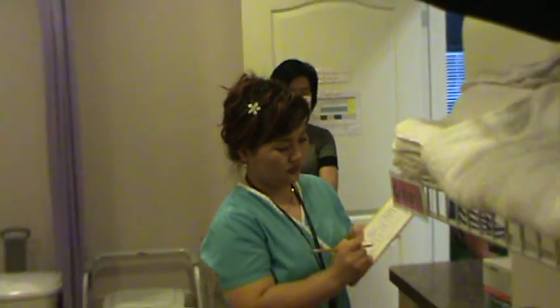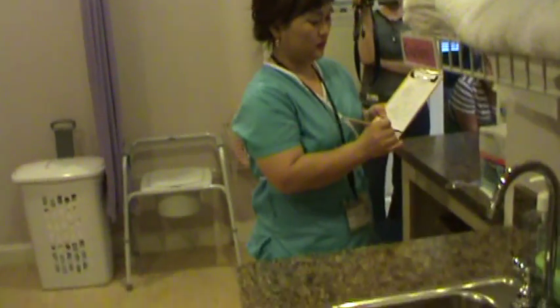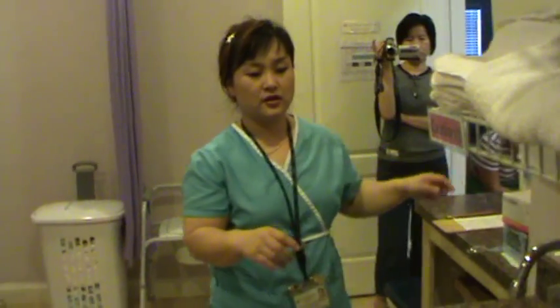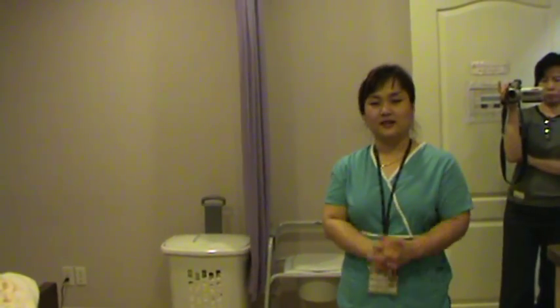Write down the patient's body weight: 151 pounds. A lot of times you will also see a chart to convert to kilograms. And wash your hands for at least 15 seconds. Since the patient is okay and he's waiting for the therapist, he's fine, and I'm done.